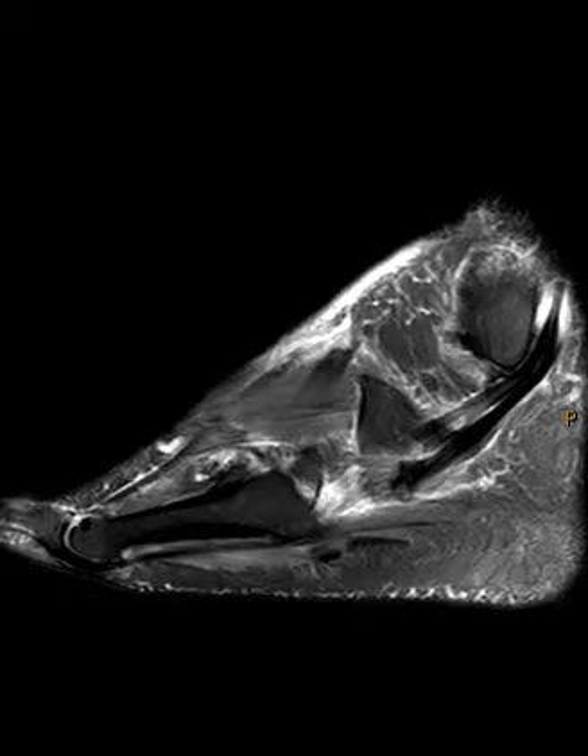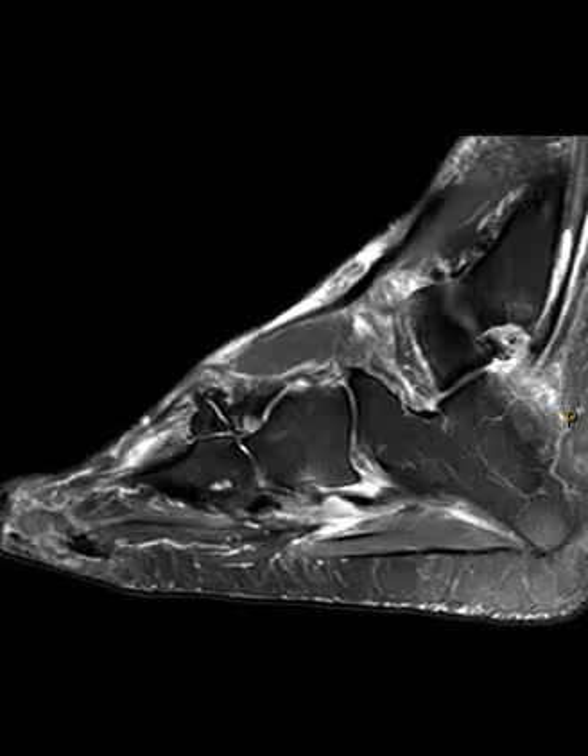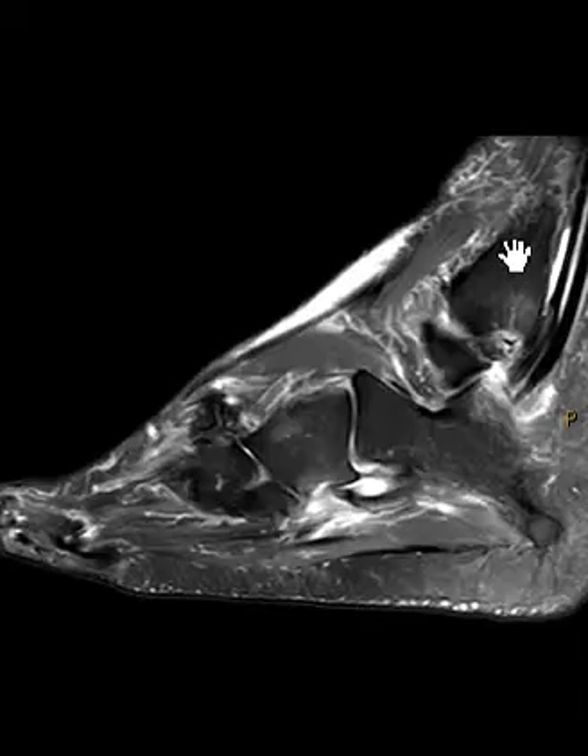Hello, this is Dr. Gay from FirstLake MRI. This is a 73-year-old male with lateral pain. The physician is worried about a peroneal tendon tear, and indeed they do have some injury of their peroneus longus tendons. This is a quick little video to show you the peroneus longus and brevis tendons.